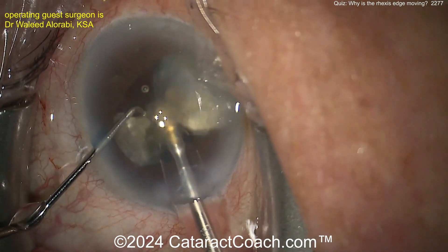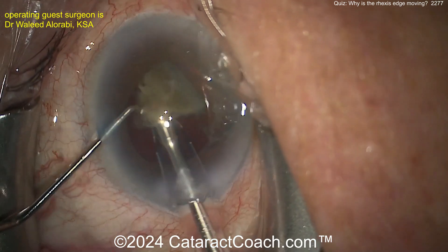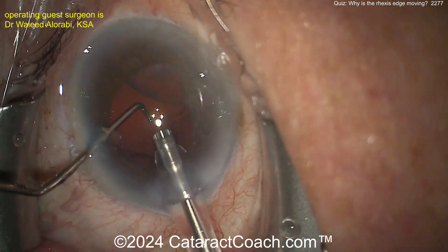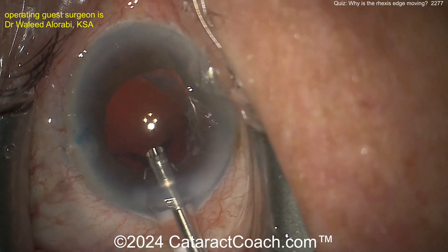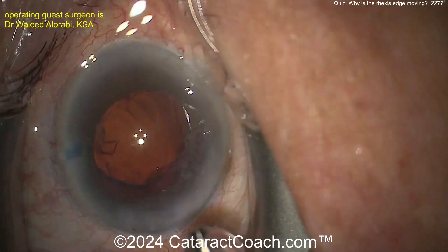Split these pieces. You could have put the CTR in already because with this type of case there's not a lot of cortical material. Taking that piece down — just be careful, because exactly as you take the viscoelastic out the nucleus comes out, and then the viscoelastic comes out. So put more viscoelastic in to push that capsule back. It looks like at least a quadrant of zonular loss.